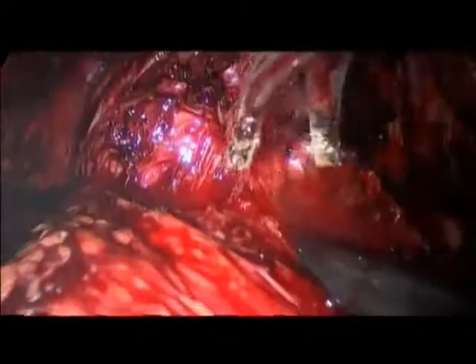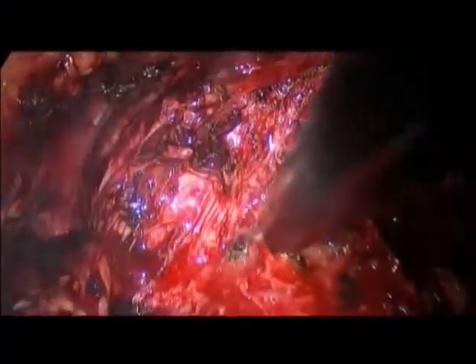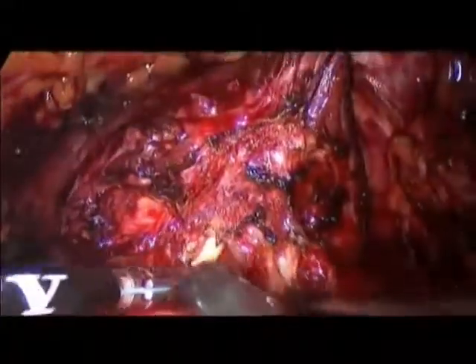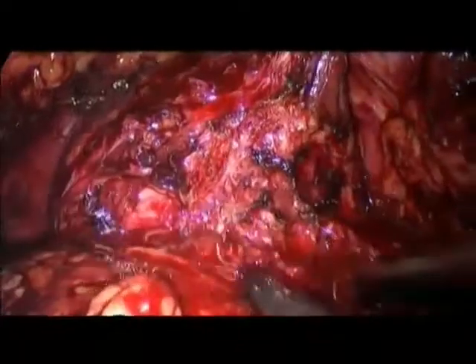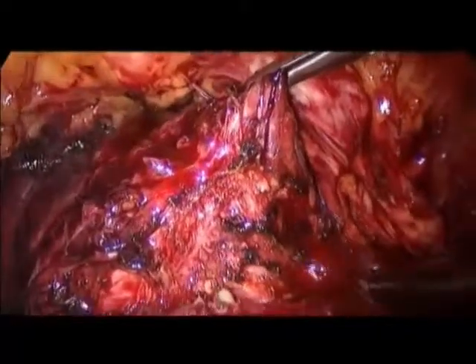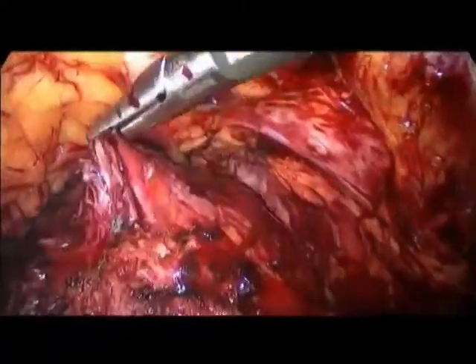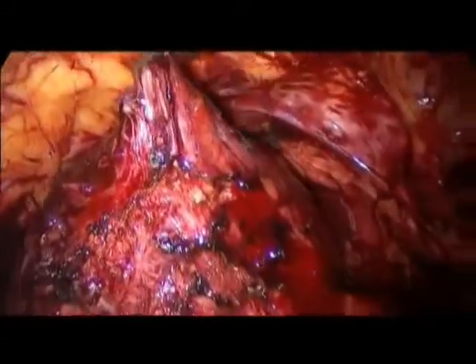Bladder. On the forceps. Yeah, this one. Okay. Deflate the balloon.